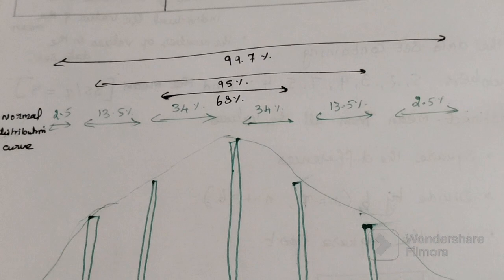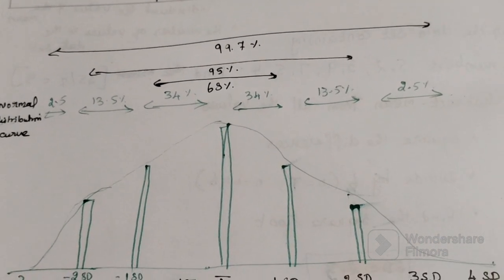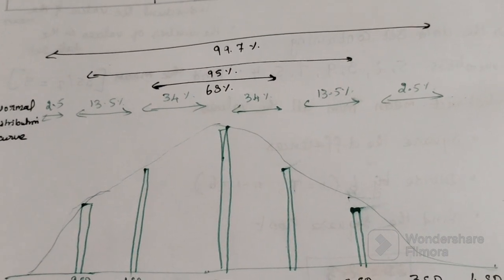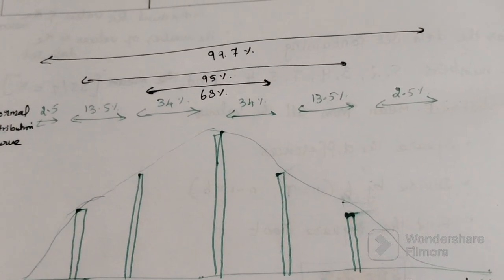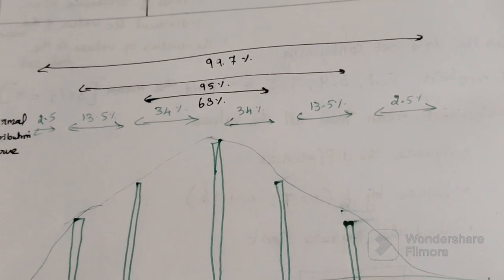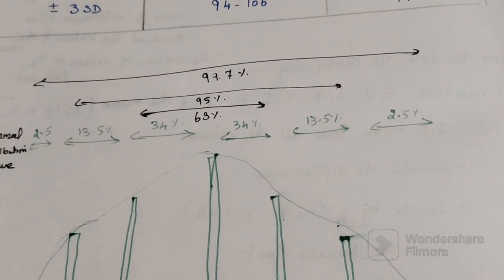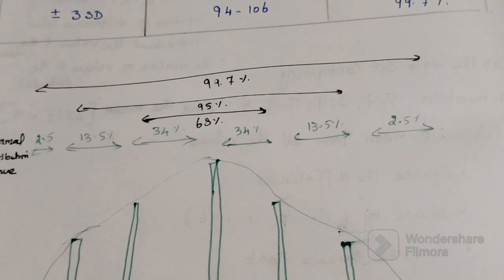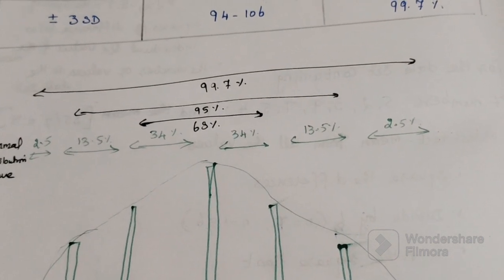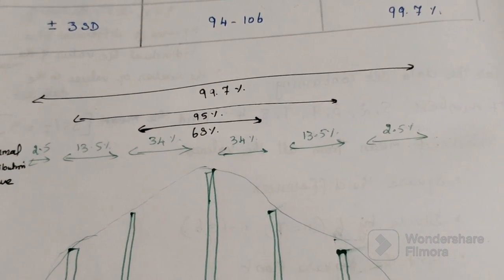Any repeated measurement will yield a degree of dispersion around that mean, that is the standard deviation. This degree of dispersion varies as per the parameter measured, and in a stable analytical system both the mean and standard deviation stay within a certain limit and fairly constant.